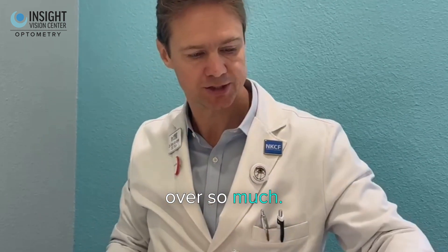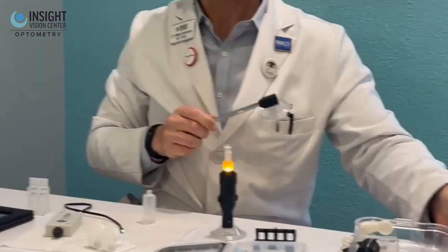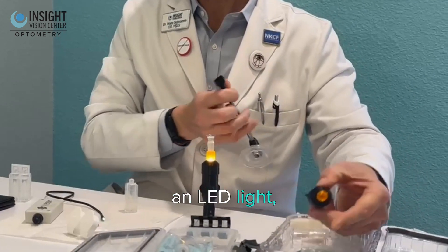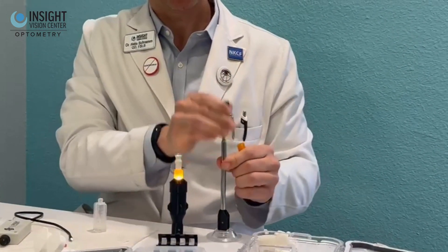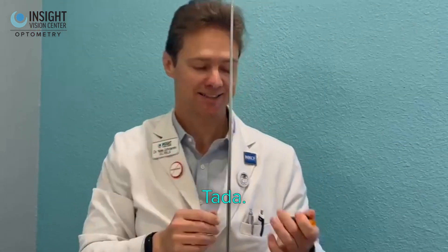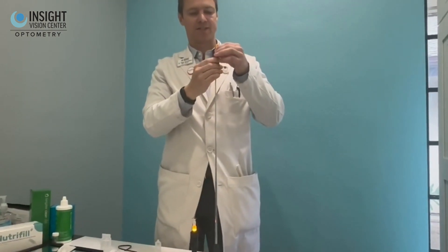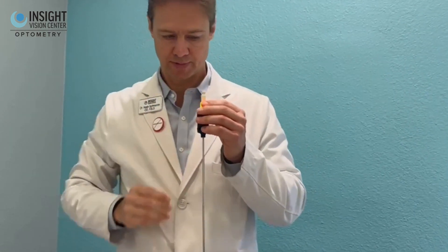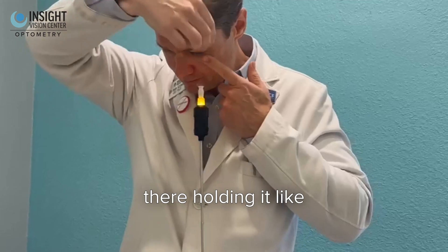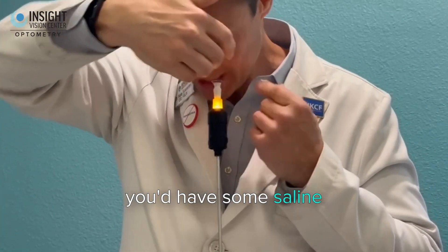If the patient has issues with bending over, our last option is one that also has an LED light but goes much higher. Then we can do the exact same thing — they hold it like that and just go onto it. Obviously you'd have some saline in here, so it would be comfortable.